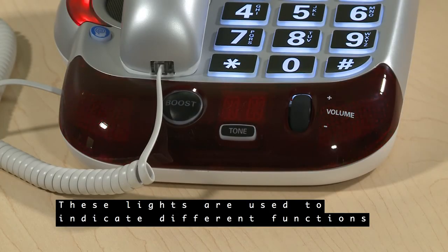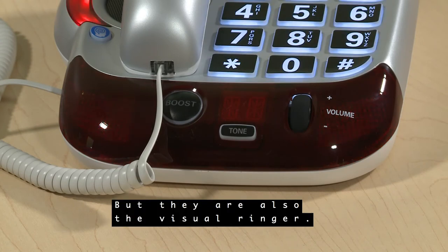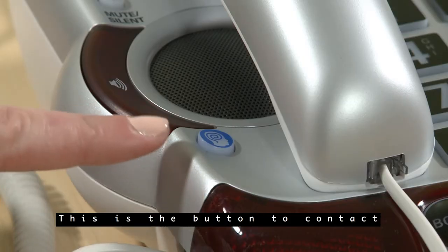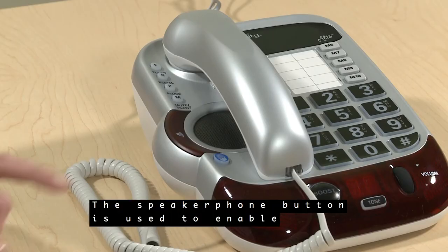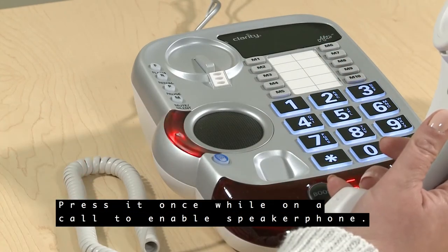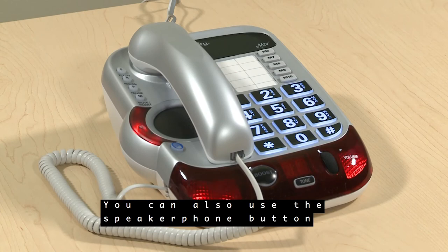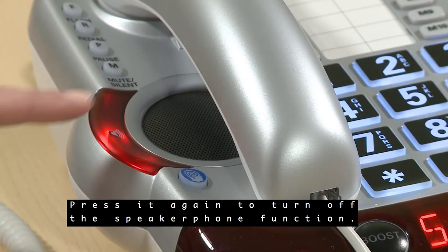These lights are used to indicate different functions of the phone, but they are also the visual ringer. When you receive a call, the lights will flash to let you see visually that the phone is ringing. This button is used to contact a Clarity Customer Care representative. The speakerphone button is used to enable the speakerphone function. Press it once while on a call to enable speakerphone — a red light will indicate that speaker is on. You can also use the speakerphone button to answer an incoming call in speaker mode. Press it again to turn off the speakerphone function.